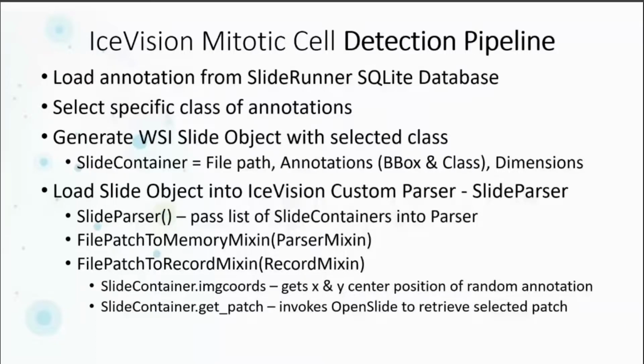The actual size depends on the digital representation of that cell, which depends on the actual resolution of the scanner. And so the size of the image itself, we have as it's recorded by the scanner. And so we're able to translate the resolution into the individual patches.